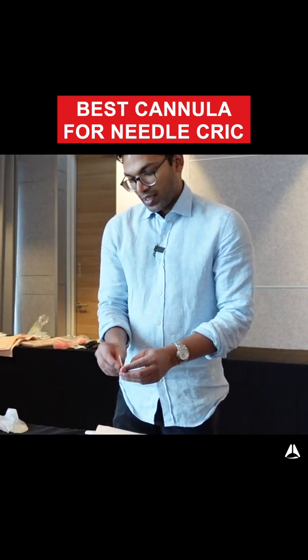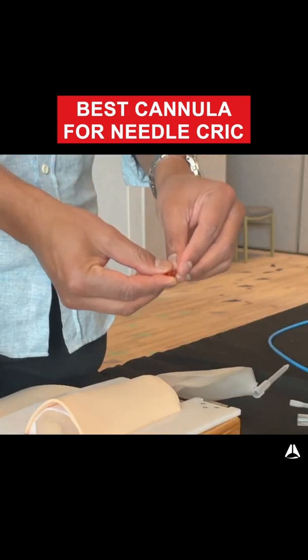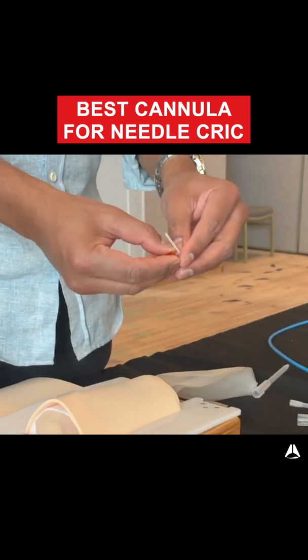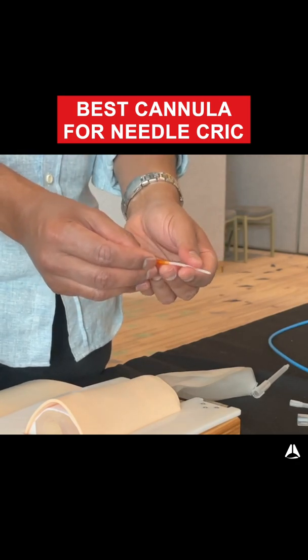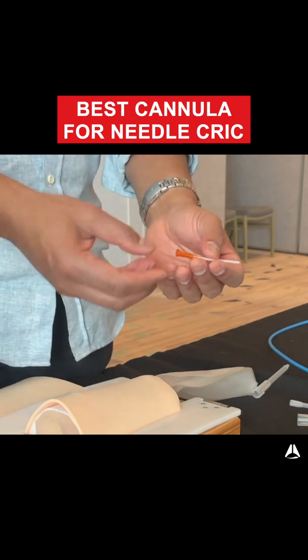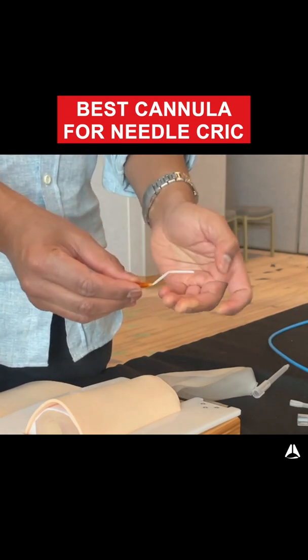One other really special part about this is that the cannula plastic doesn't have memory. So if you were to scrunch this up like so, it just folds back into the right kind of trajectory and stays patent. That's really important when you're doing surgical airways.